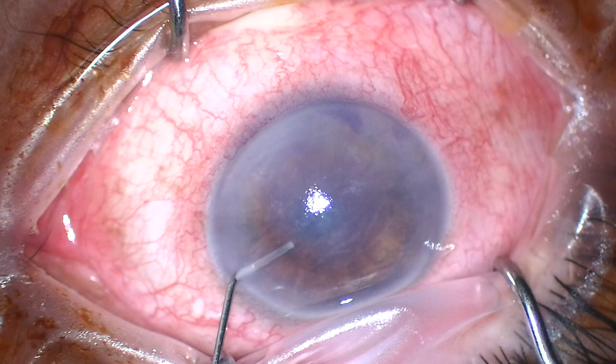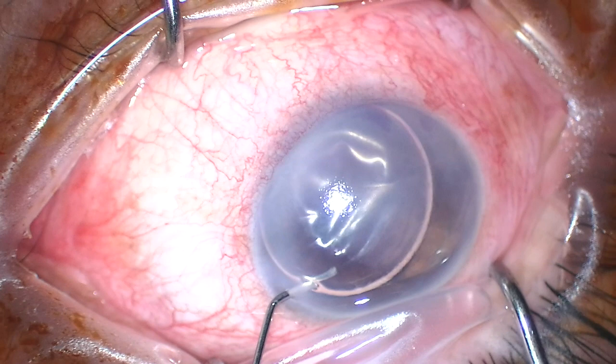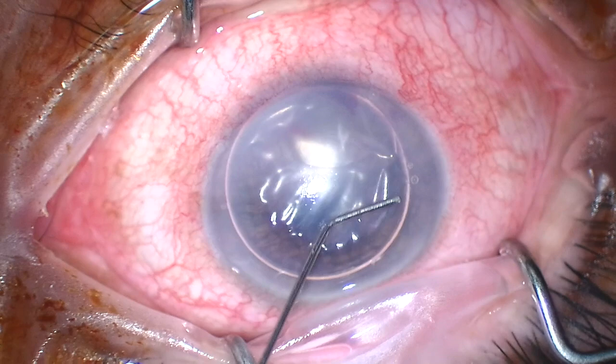I went in with a cannula where the cornea was not edematous, and then injected air carefully. What you can see is that a Descemet's detachment defines itself nicely when air is put inside the eye. You can see the wrinkles, you can see the area where normal appearing light reflexes off the bubble occur, and where you have that cellophane appearance of the discrete detachment. I still don't see an area where it is torn or where there was a discontinuity in Descemet's.